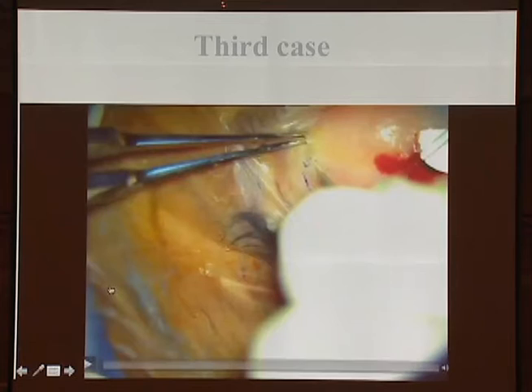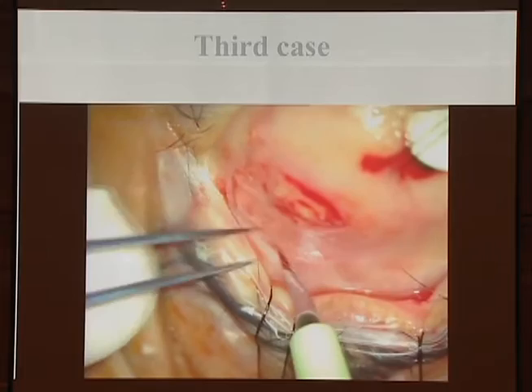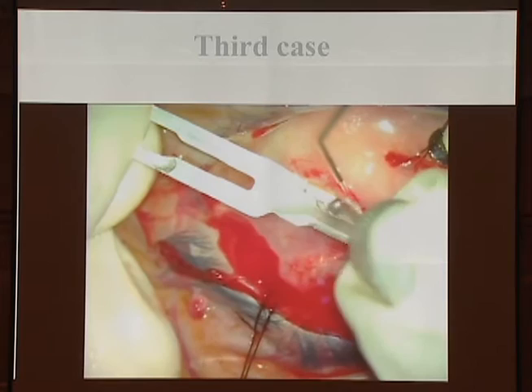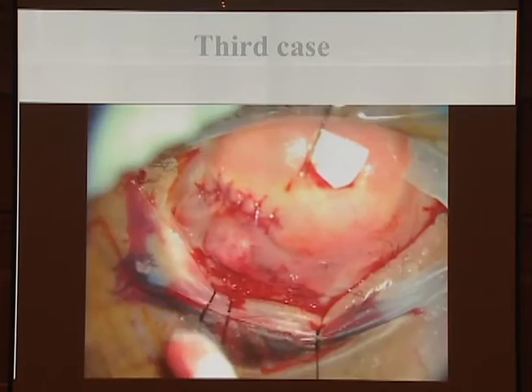This required a second intervention, which I performed, removing the buccal mucous membrane around the exposed area and doing a releasing incision superior. It is the same idea as the previous case, undermining the buccal mucous membrane to slide this to cover the bone, grinding off the exposed bone, and then suturing it and leaving the bare upper part to granulate.